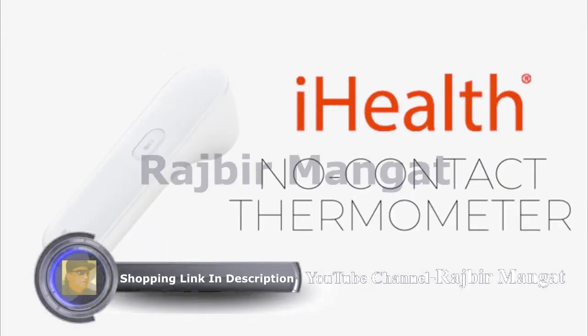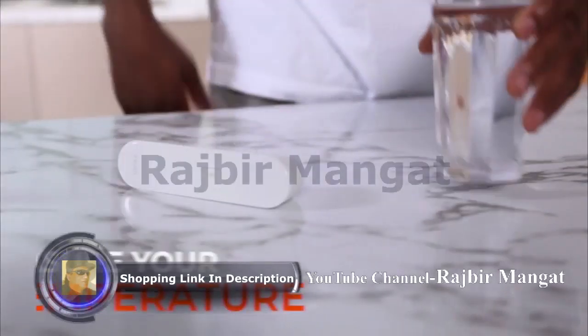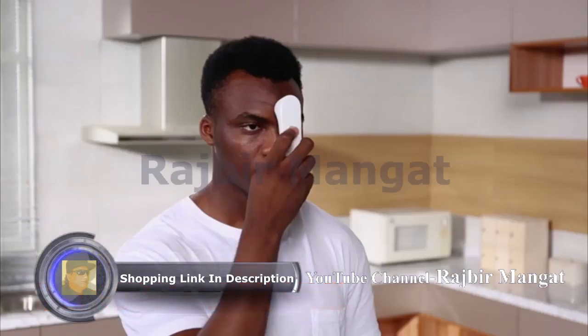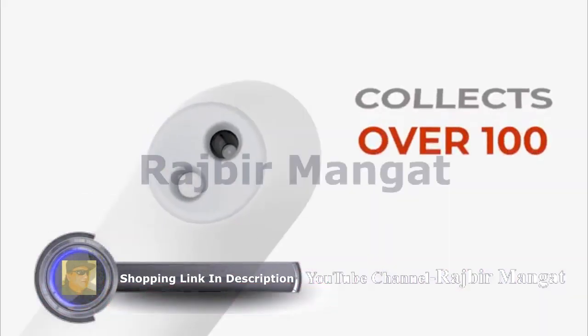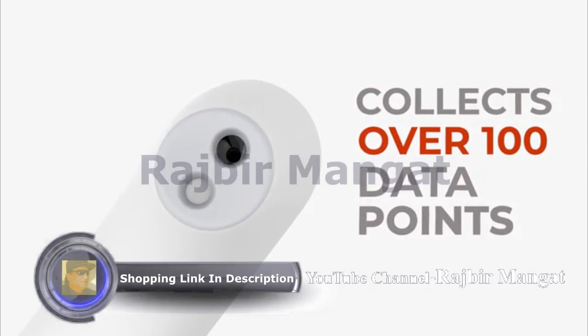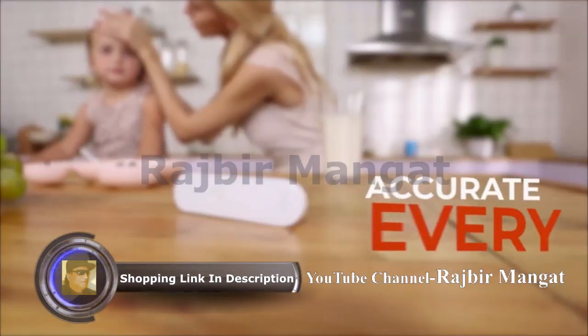Introducing the iHealth No Contact Thermometer. Measure your temperature instantly — you'll see results in just one second. The infrared sensor collects more than 100 data points, getting accurate results every time.